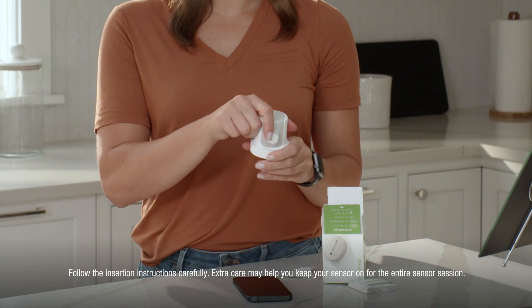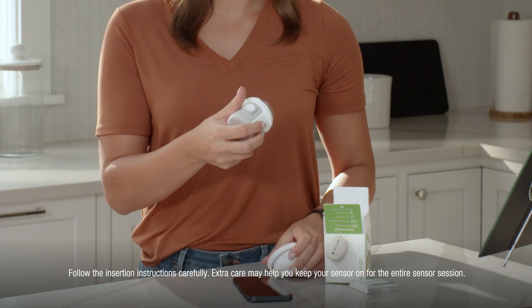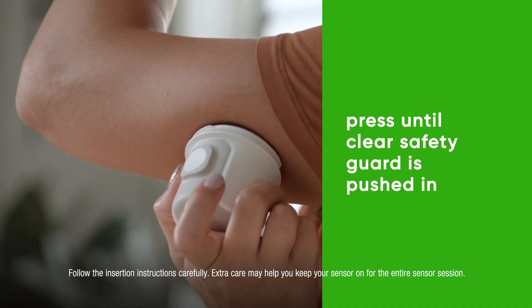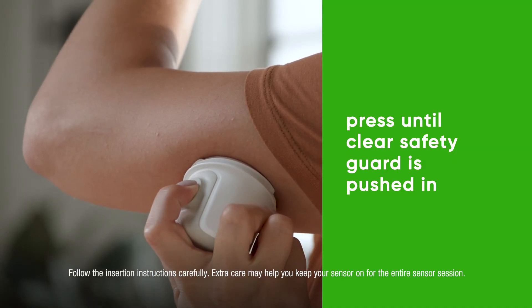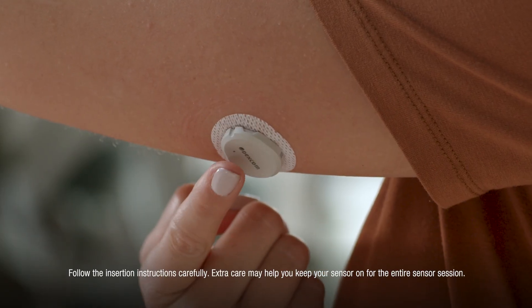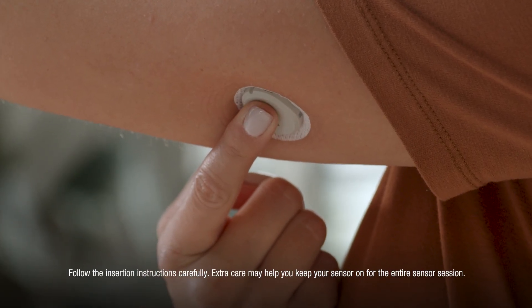Don't touch inside the applicator. Push the applicator against your skin until the clear ring disappears. Keep it pushed in and press the button. Remove the applicator.